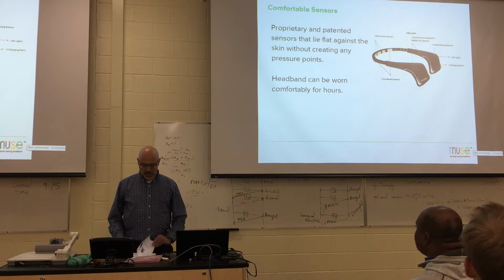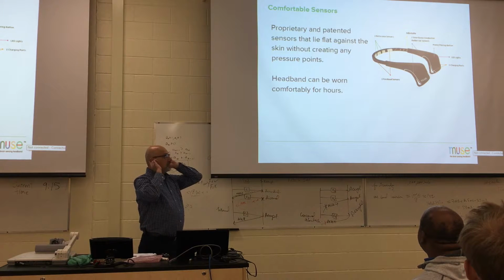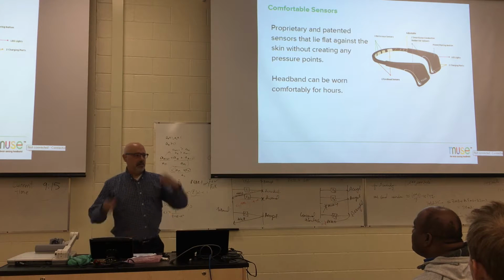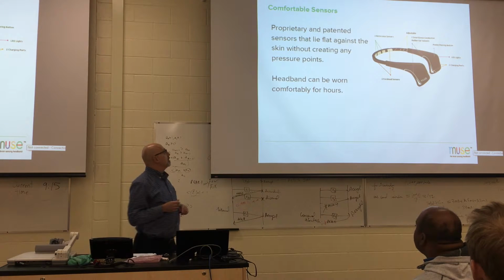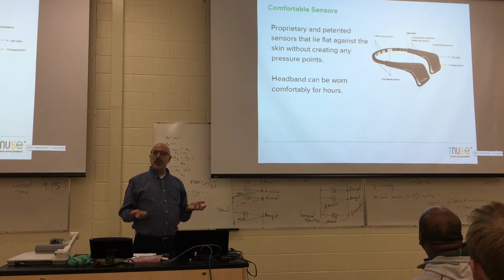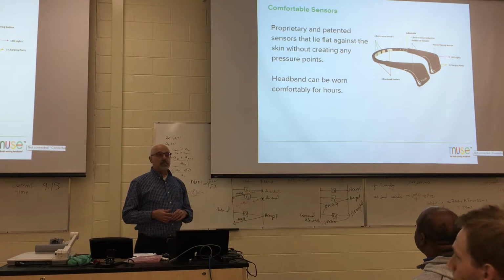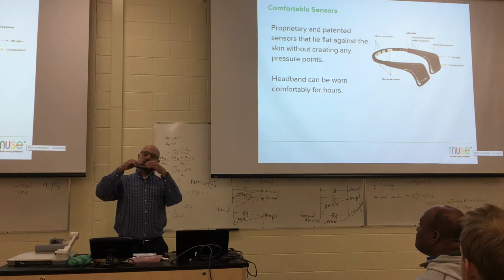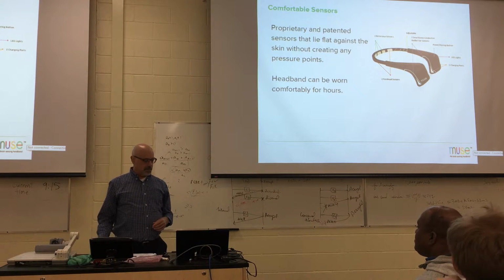So this is a little more information on the Muse. It has sensors in the front. The ears are conductive rubber. So we're actually getting 4 channels, and there's a reference in the center of the forehead, and then there's a DRL circuit which provides noise cancellation. It's created to be comfortable and worn a long time, but also at good signal quality. These are adjustable, and there's a little bit of spring tension to hold the headband in place.